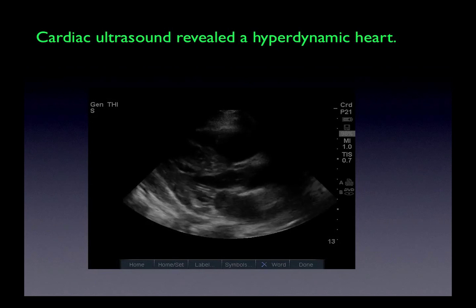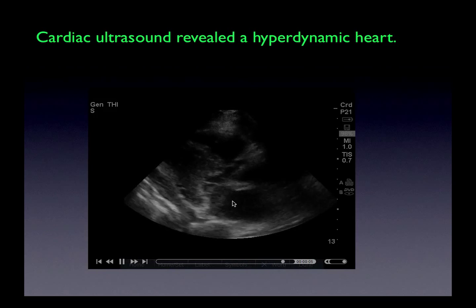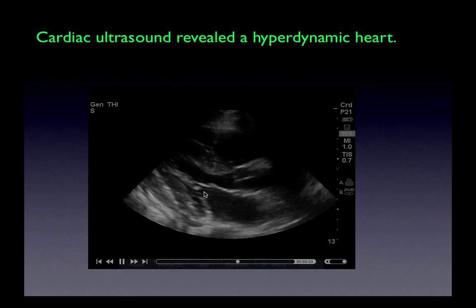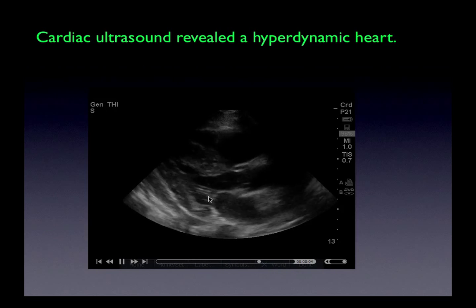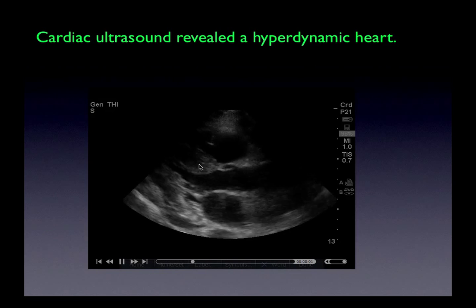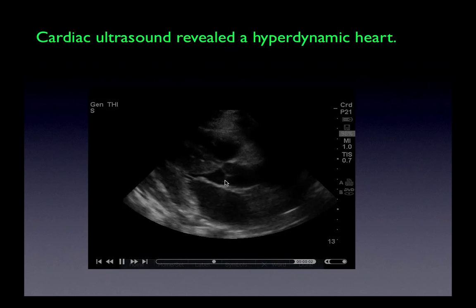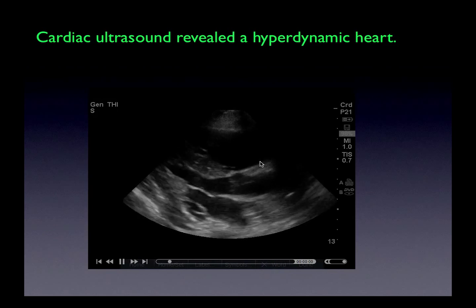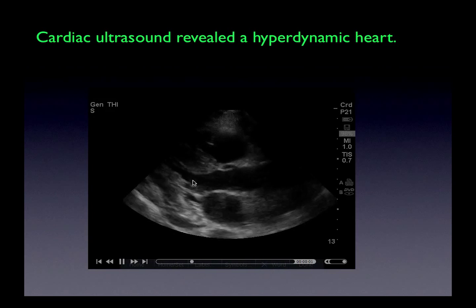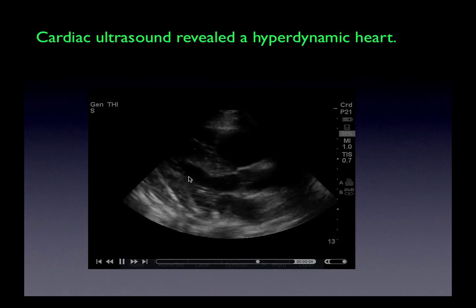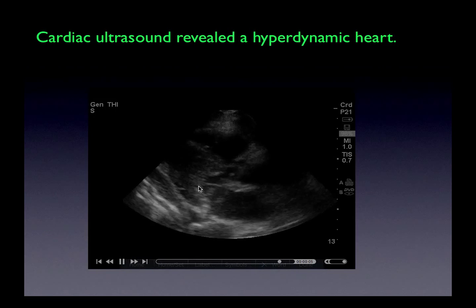Cardiac ultrasound revealed a hyperdynamic heart. Let's take a look at this parasternal long view. Here's the left atrium, the mitral valve being pulled by the chordae tendineae into the papillary muscle. Blood flows from the left atrium through the valve into the left ventricle — here are the walls of the ventricle and the septum. Blood flows out the aorta past the aortic valve, and the right ventricle is up here. We can see there is essentially total obliteration of the left ventricular cavity as the heart beats — this is a hyperdynamic heart.